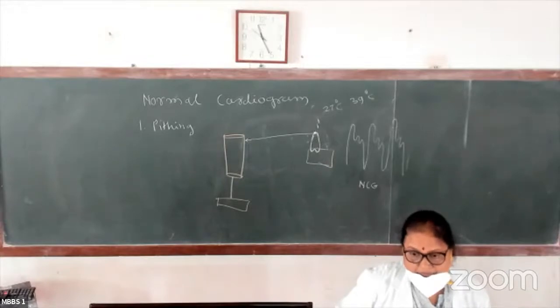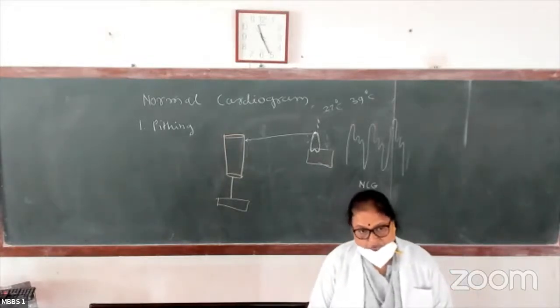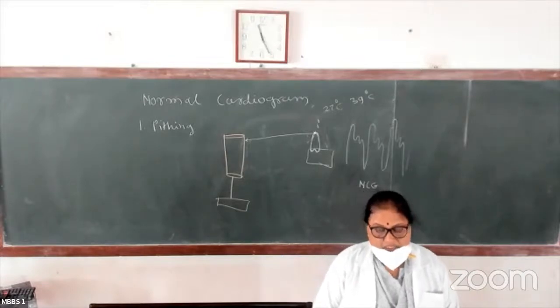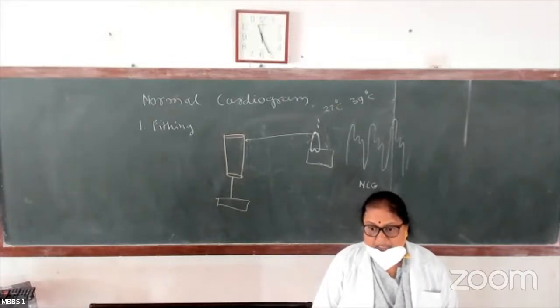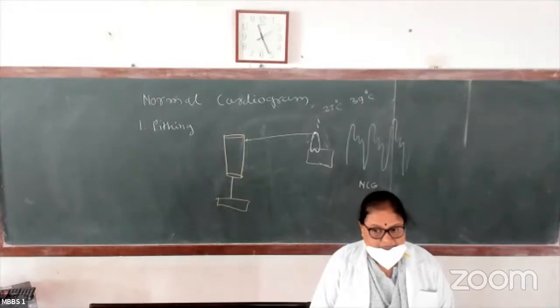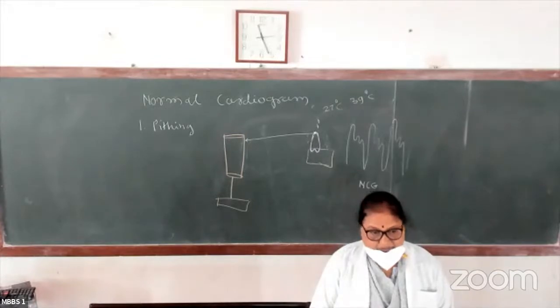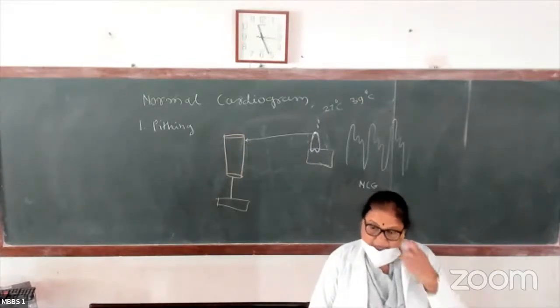Any change in the recording or not? What change will be there? Does the graph remain the same? What change? Heartbeat increases. Why?